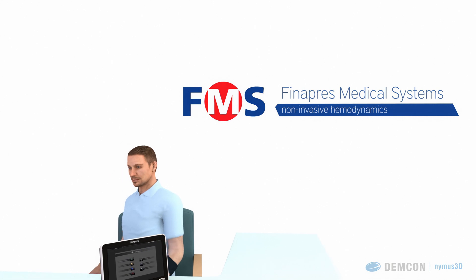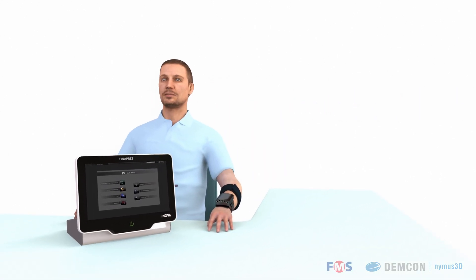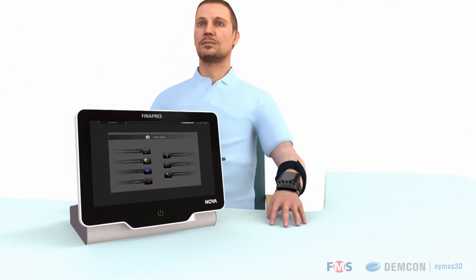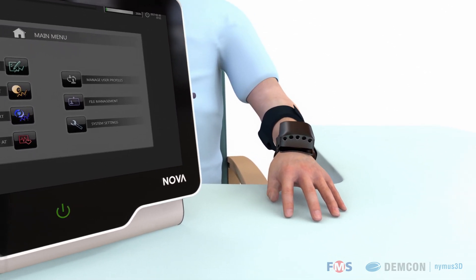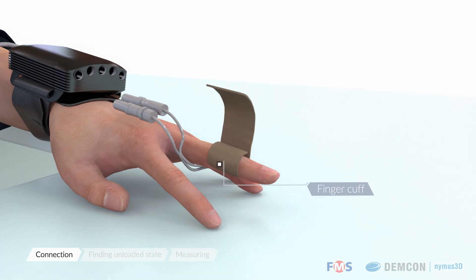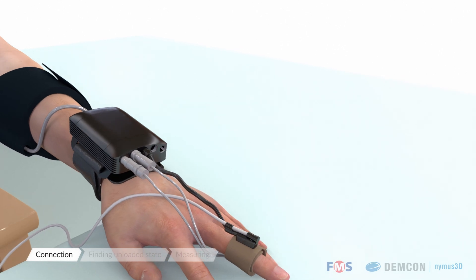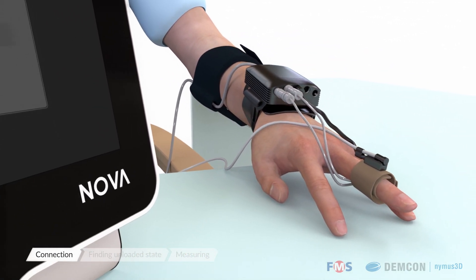Finapres develops medical devices and software for continuous non-invasive blood pressure measurement and hemodynamic monitoring. With these devices, the entire complex waveform of the blood pressure can be recorded beat to beat. The system consists of an inflatable cuff on the finger for recording, the nano-core on the wrist for processing, and the NOVA for measurement control, visualization, and recording.